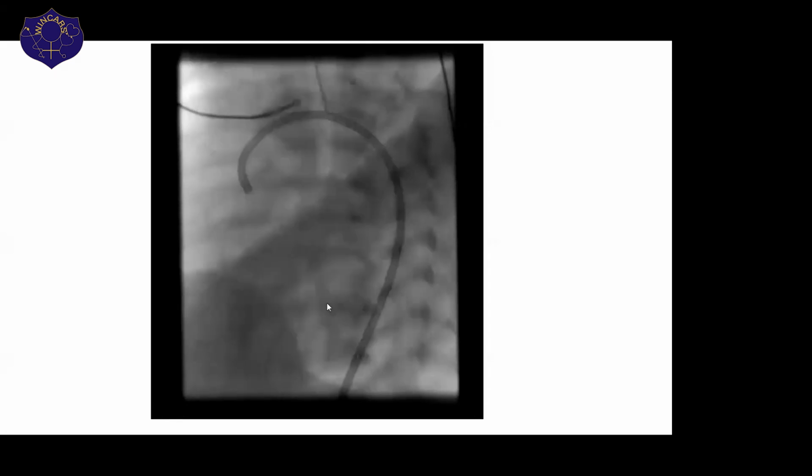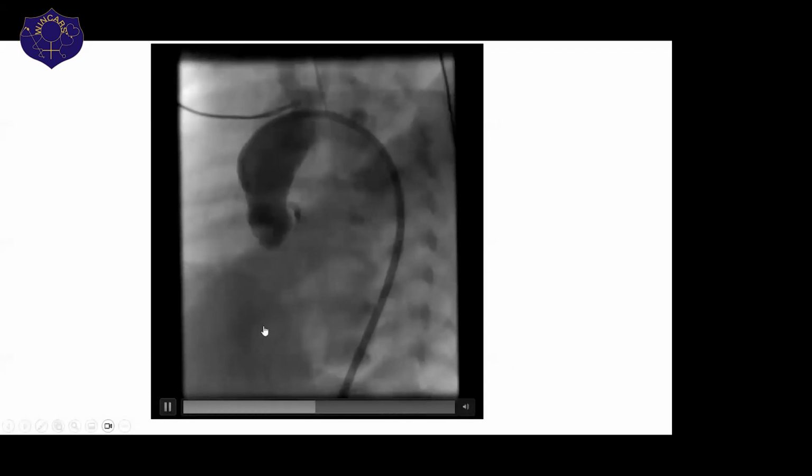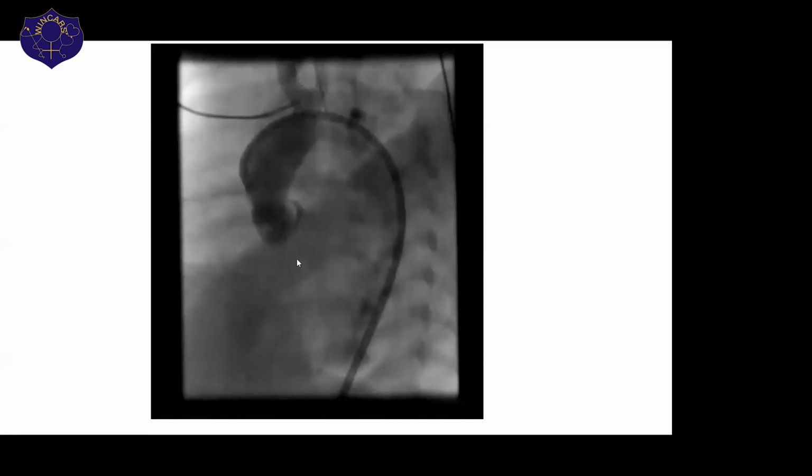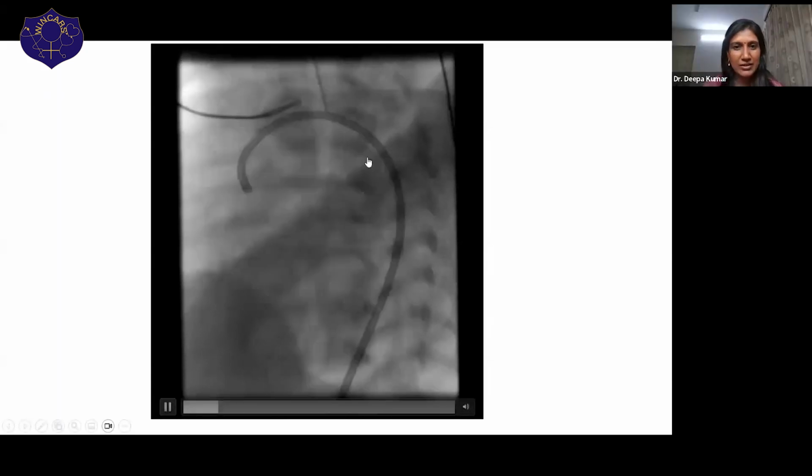You answered bovine arch. Yes, very good. Somebody noticed the bovine arch. Yes. Anything else? Doming and reverse doming, BAV with post-stenotic dilatation. Severe AS, interrupted arch, bicuspid valve with Prussian helmet. Yeah, it's not interrupted. You can see a PDA because somebody had started prostaglandin for a duct dependent systemic circulation.